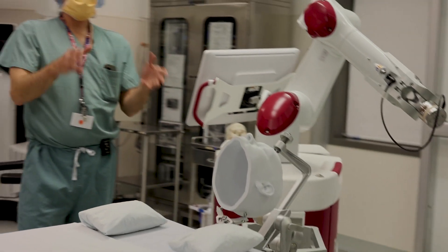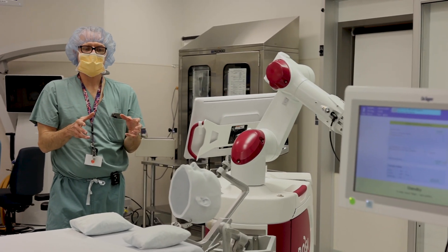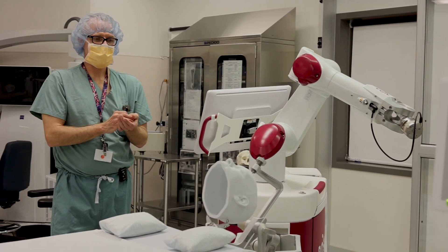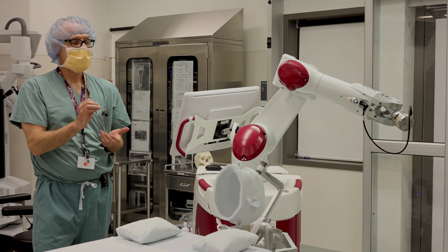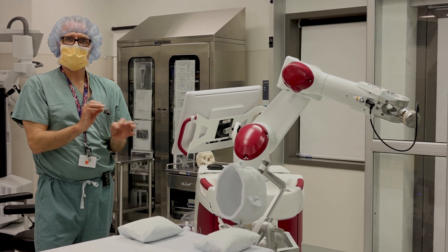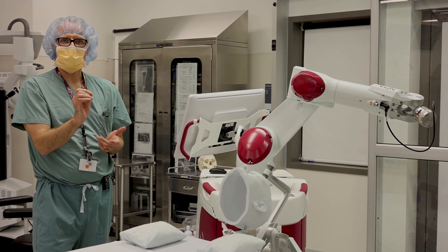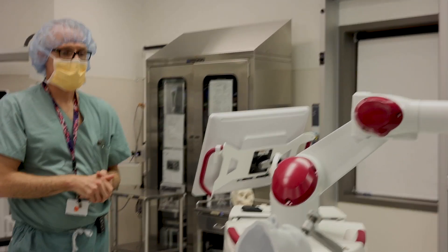We do a registration of the head so that Rosa knows where the head is at all times in three dimensions. We confirm that registration by checking points on the face, the forehead, and the head, and usually the accuracy is millimetric — if we're off at all, we're off by a millimeter. The last case we did it looked like it was perfect — probably the best case we had done.